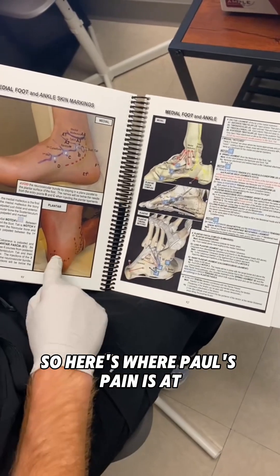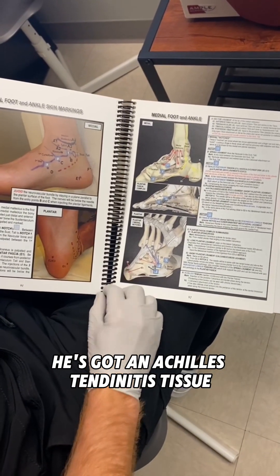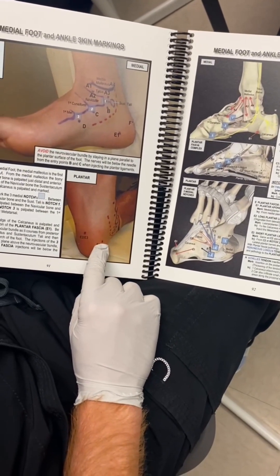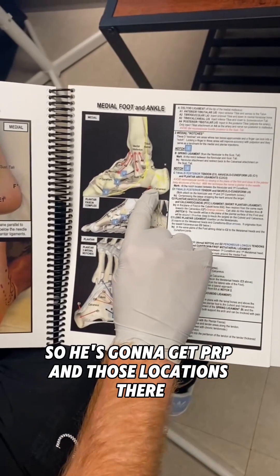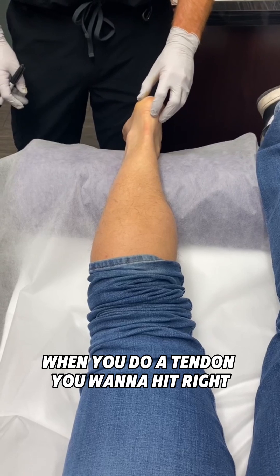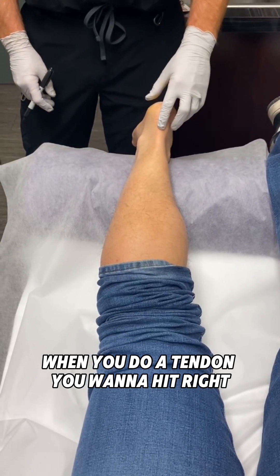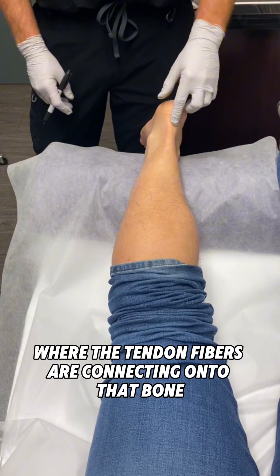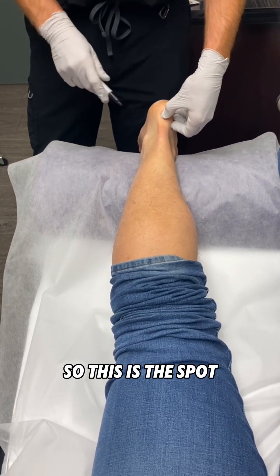So here's where Paul's pain is — he has an Achilles tendonitis issue. Go ahead and point to where we're going to inject. He's going to get PRP in those locations. When you do a tendon, you want to hit right where the tendon fibers are connecting onto the bone — that's the spot.